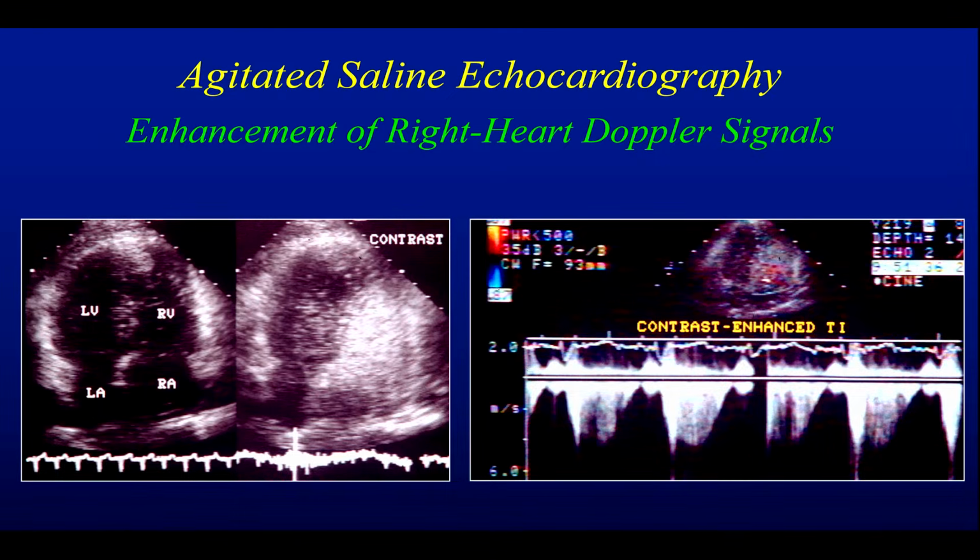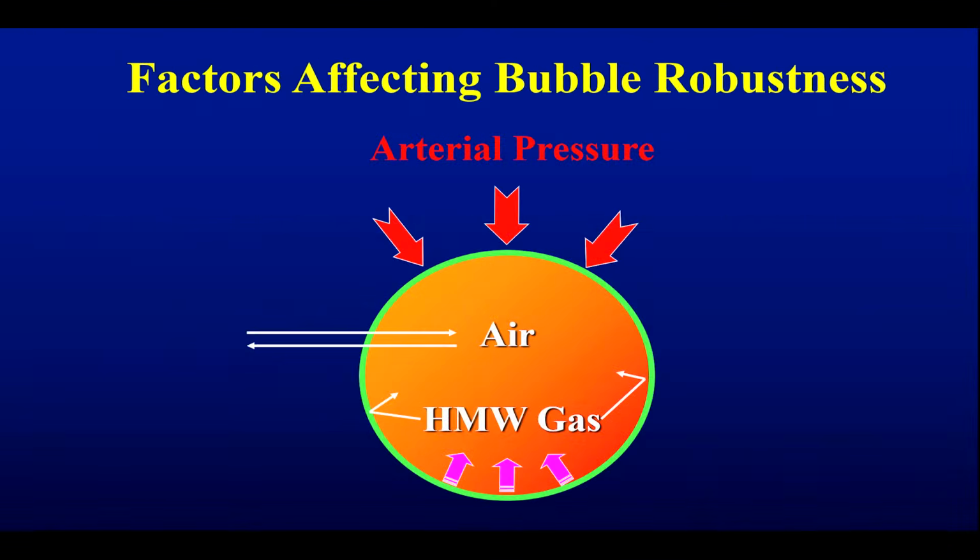Enhance it. And I think this is important when understanding and measuring what the PA pressure is in the circulation, be it at rest or during exertion. So we always do that. And it is cheap, so you don't have to use the newer ultrasound agents to be able to do that. So I think that is suggested.